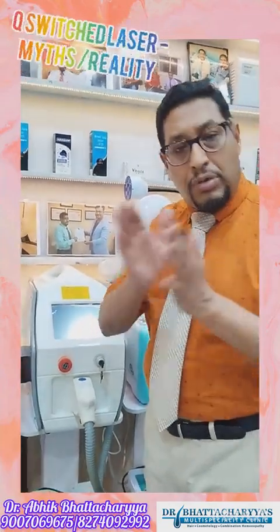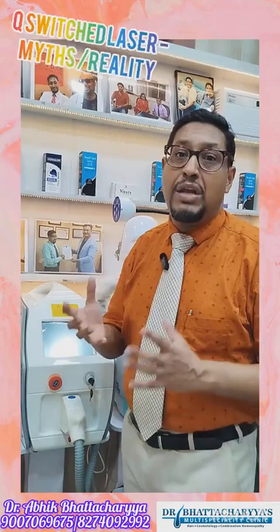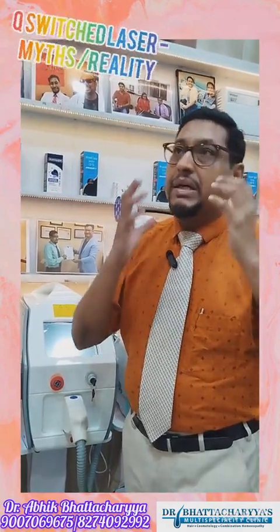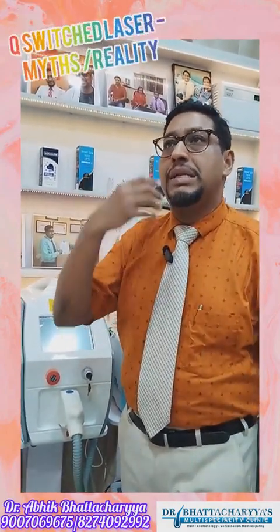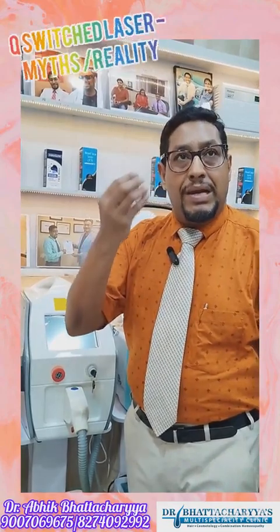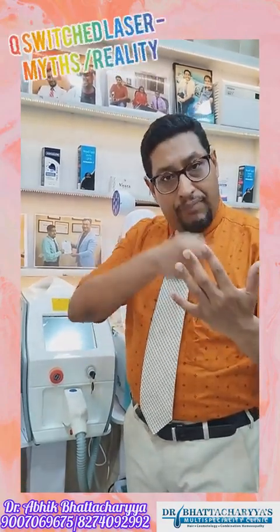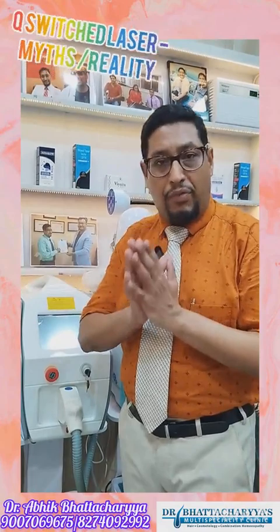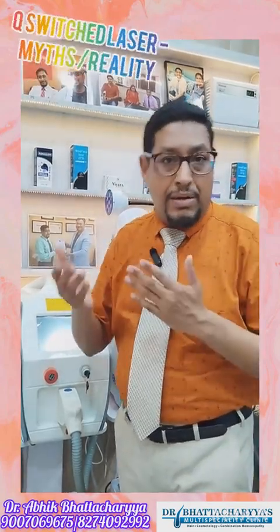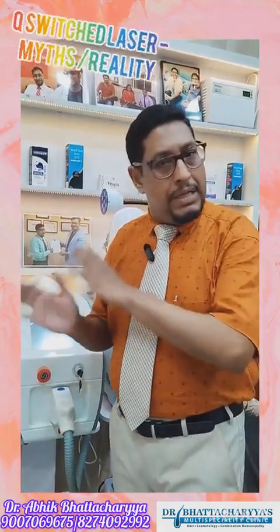Q switch mode is different, non Q switch mode is different, but with the same machine. That non Q switch mode, the free running mode, helps for laser toning. It also helps to reduce skin texture problems, where some people continuously start developing small maculopapular rashes, maybe acne, pimples. All these can be reduced beautifully by the free running mode of these lasers, because this mode helps to kill the bacteria, especially the Propionibacterium acnes, which actually develops the acne. So all this can be done by the machine.